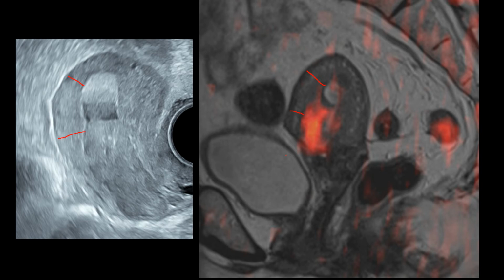But if we look at this part here, it has completely lost the myometrial thickness. It is located here because the uterus has been stretched by the position of the transducer at the posterior fornix. So we have two assumptions here.